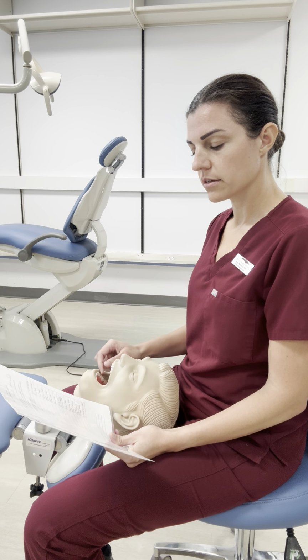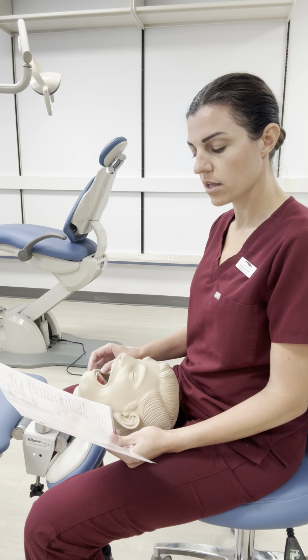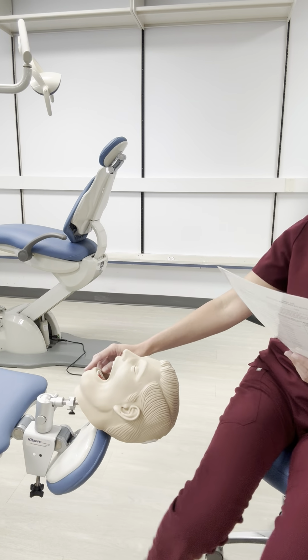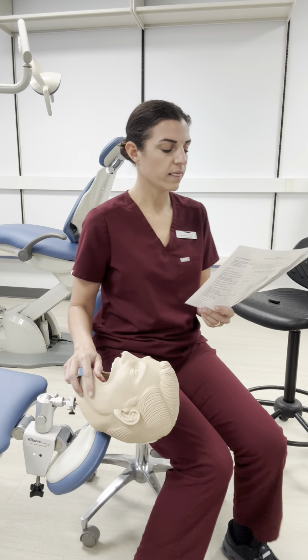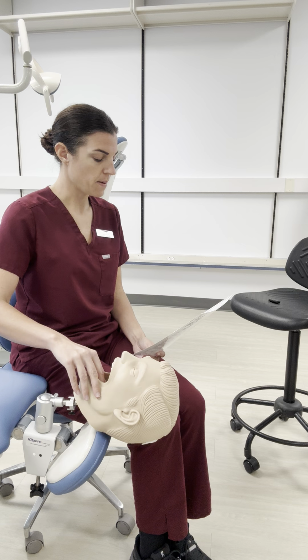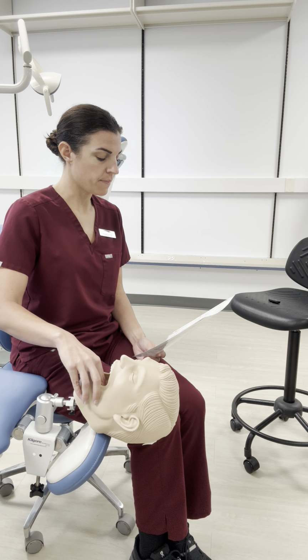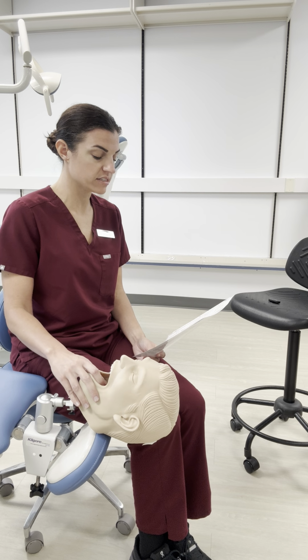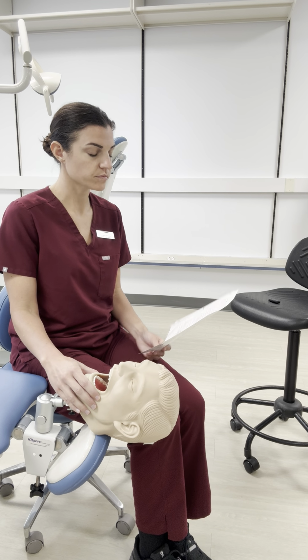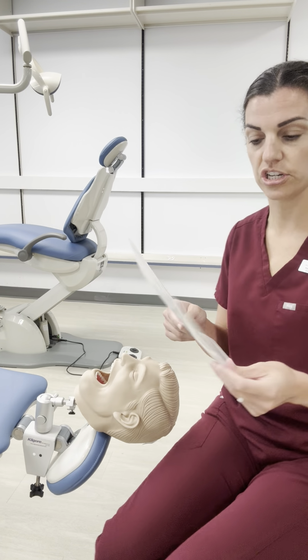All right. And then the mandibular left lingual, we're going to be at 8 o'clock for that. That's that very last box there. Mandibular left lingual, so that's the opposite side from me, but it is a toward surface. That is going to be chin down, patient slightly turned away so I can see things directly. Now we have the left-handed seating position.